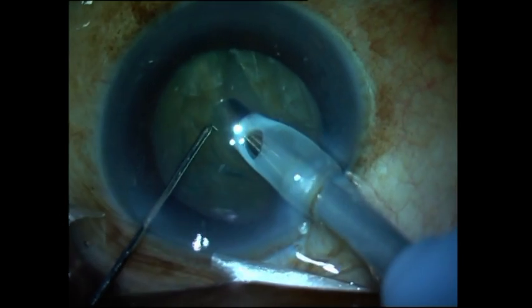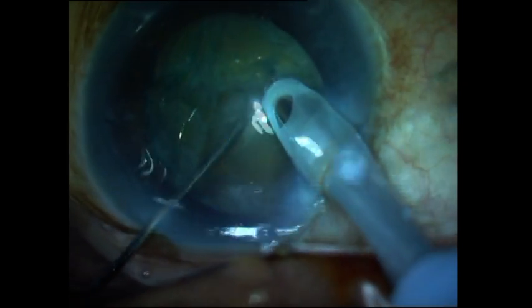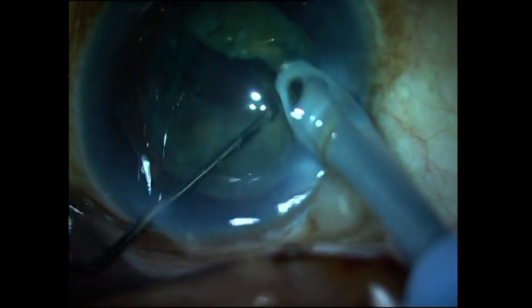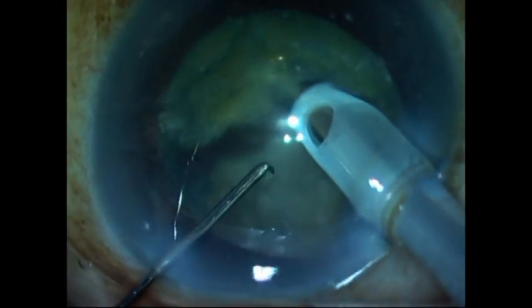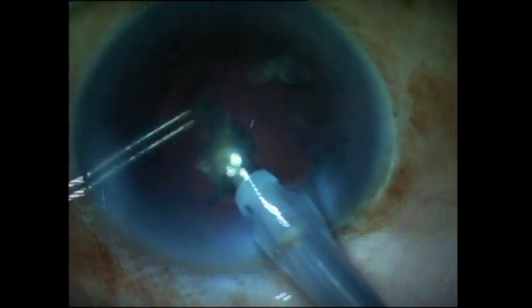Hydro dissection should never be performed in a posterior polar cataract. Here I do a stop and chop — I've created a trench first, then divided the nucleus into two halves, and then emulsify the rest of the nucleus. At no point should posterior pressure be applied on the capsule, which could cause a rent to occur.